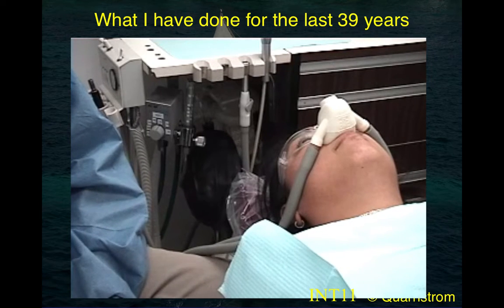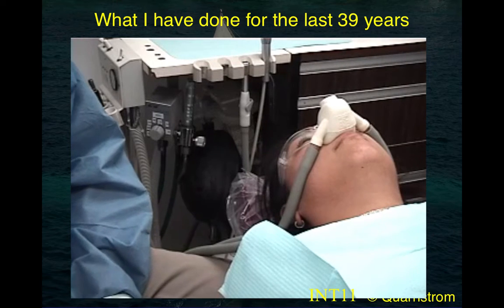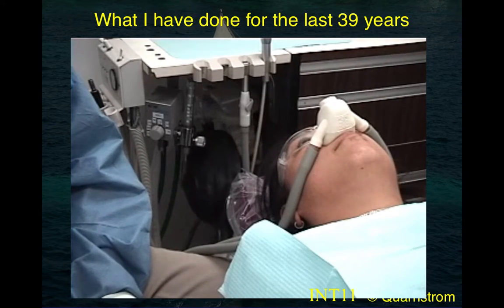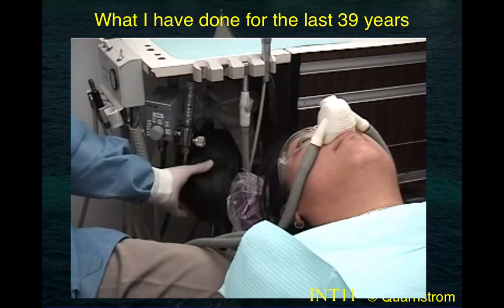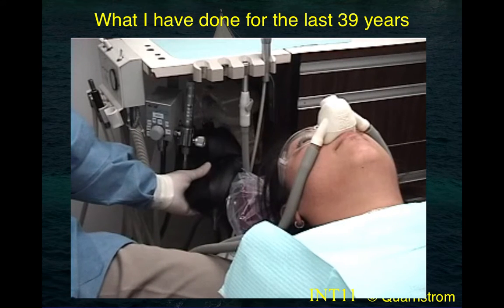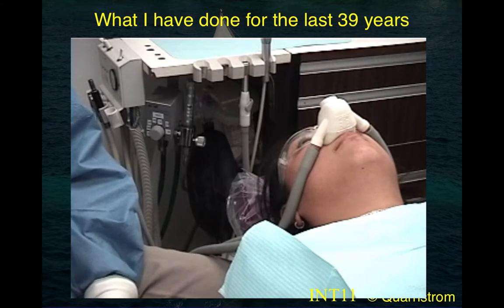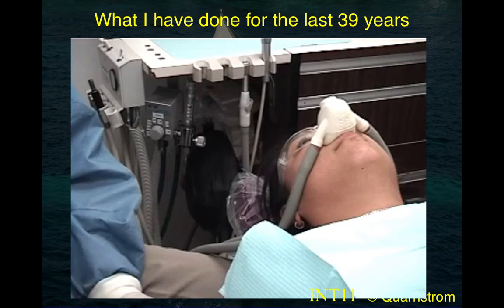But consequently, there's no reason to leave a patient on nitrous for 10, 15 minutes while you're getting the anesthetic to take effect, while you go next door to adjust a denture. If you're going to leave the patient, put them back on oxygen, let them breathe for a minute or two to get the bulk of the nitrous out of their system, and then you can go ahead and leave them knowing that when you come back, you can have them ready to go to work within a minute.